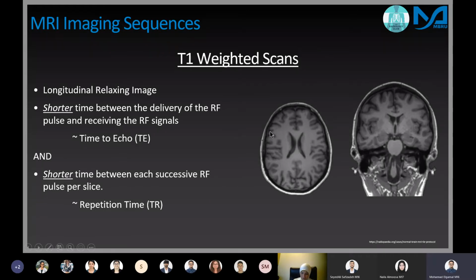You can see here on an MRI that the soft tissue of the brain itself looks a lot more detailed, which is the advantage of MRIs. They pick up soft tissue a lot better. They're done very commonly of the head, that's why I used it as an example.